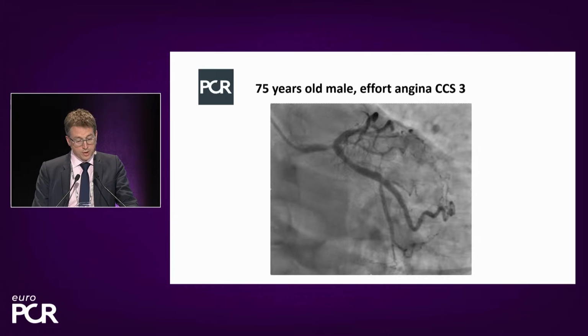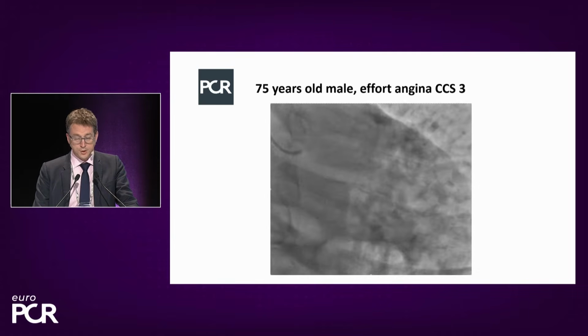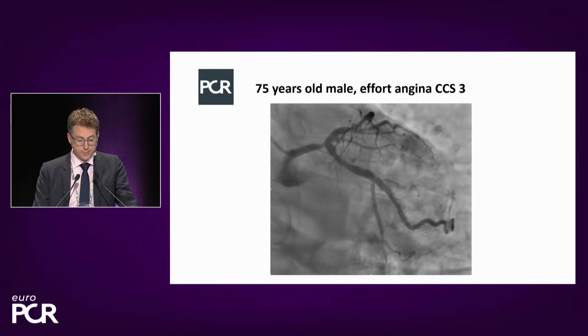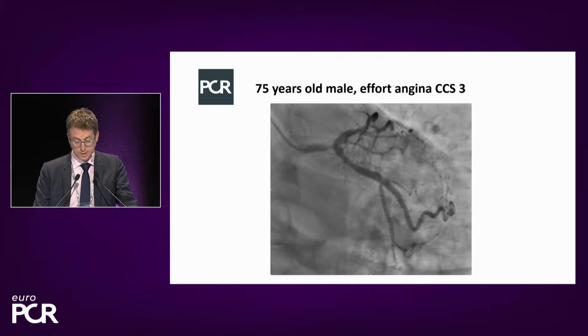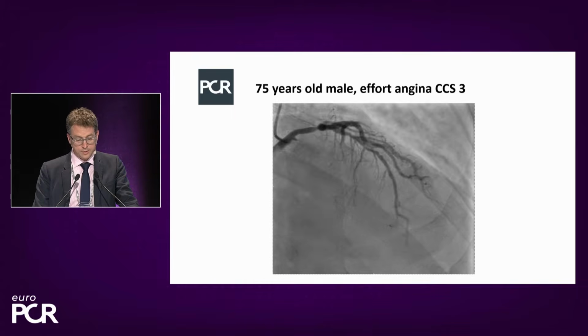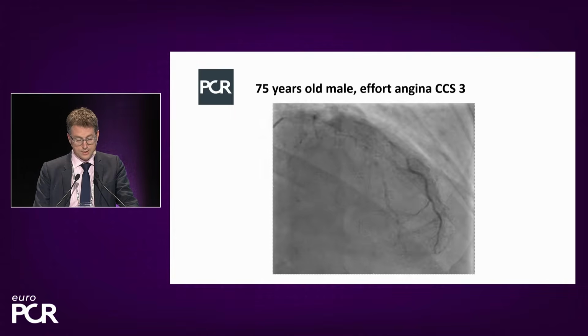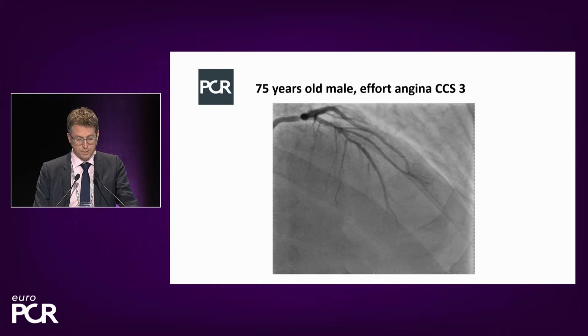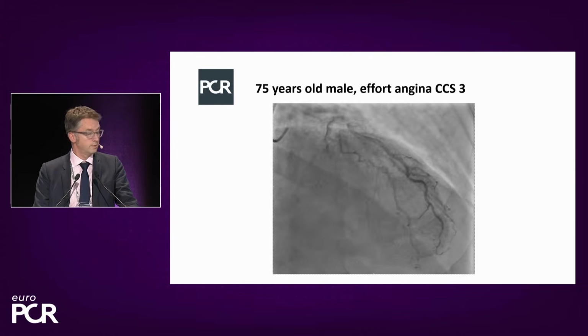And these are his coronary pictures, which we can look at together, showing moderate distal left main stem disease, a relatively large circumflex, which may be defined as codominant, and then this mid-segment LAD disease extending to diagonal. But I think at this point we turn to Francesco to review the images that we've got so far.